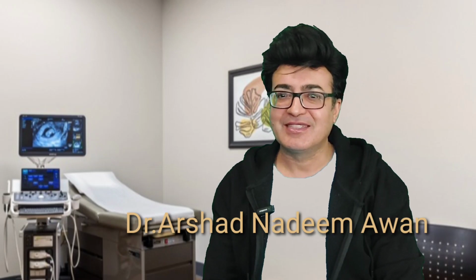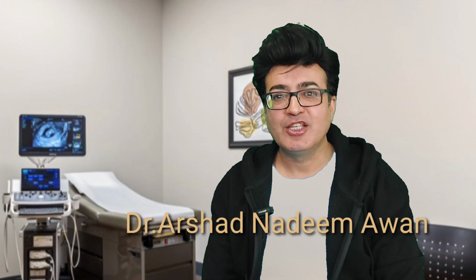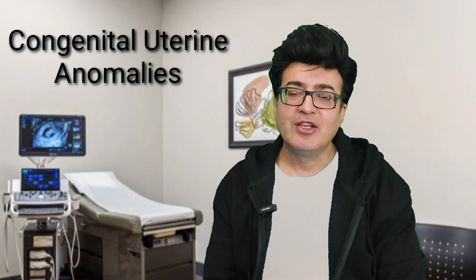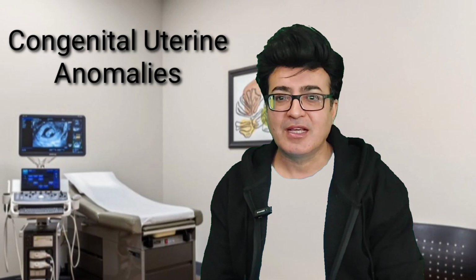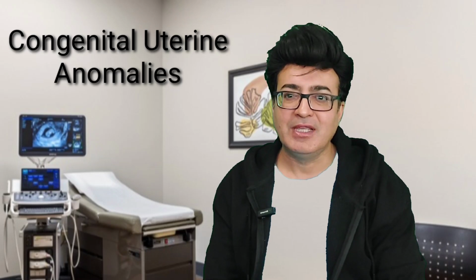Today, my topic of discussion is congenital uterine anomaly. This is one of the important topics in the gynae section, especially for those who are doing ultrasound. Sometimes it's a bit challenging to find out which type of anomaly it is, and many a time we forget what is next, which modality we will use to confirm all these congenital anomalies.